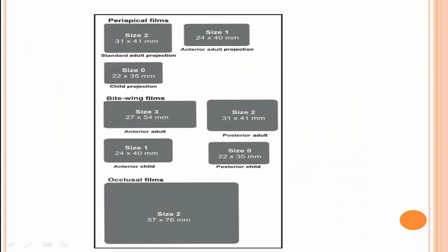These are the various size representations for the x-ray film. This is a size 2 periapical radiograph. This is a size 3 bite-wing radiograph. And this is the occlusal radiograph.